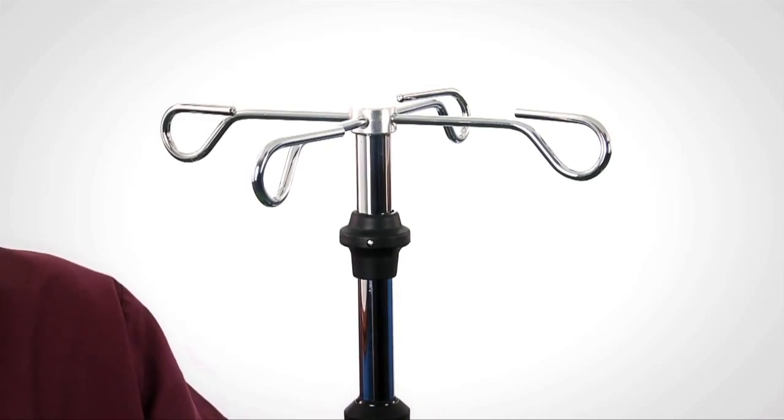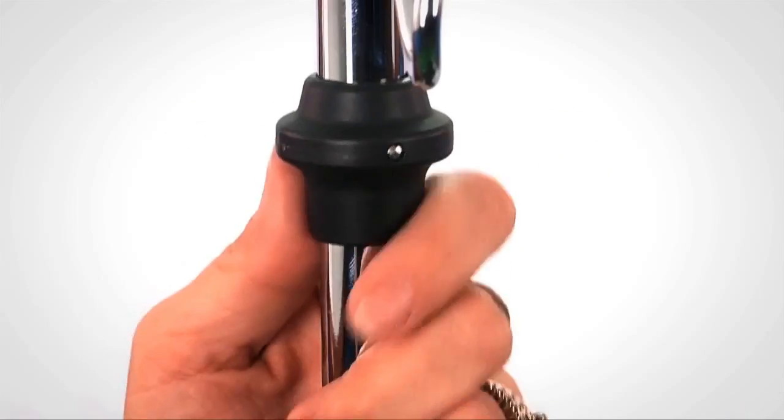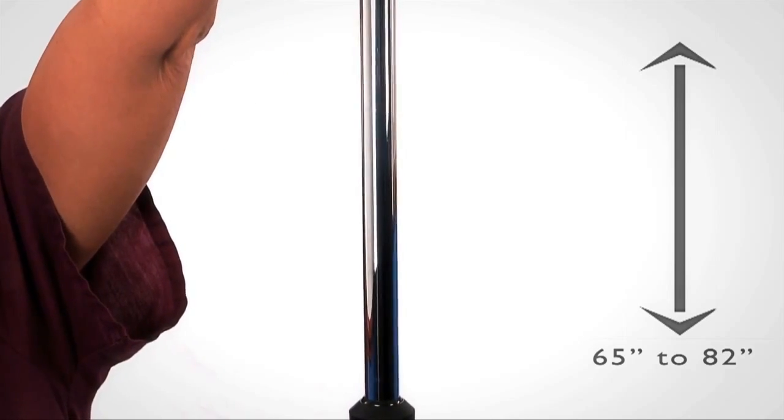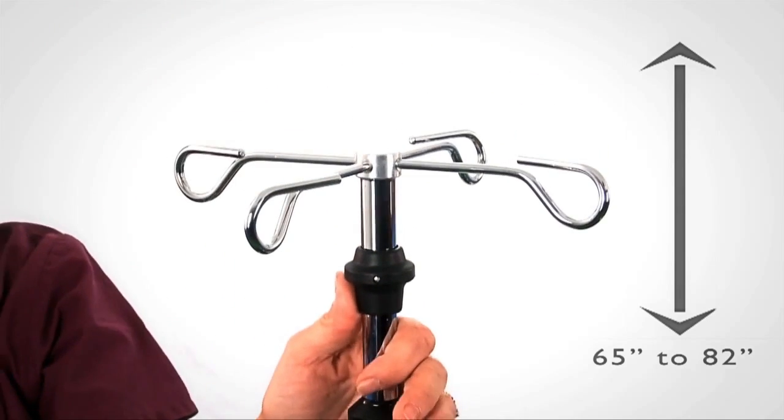or a four-hook pole with single-hand adjustment. To adjust, simply grasp onto the pole and push up on the loft. The height can be adjusted to any height from 65 inches to 82 inches.